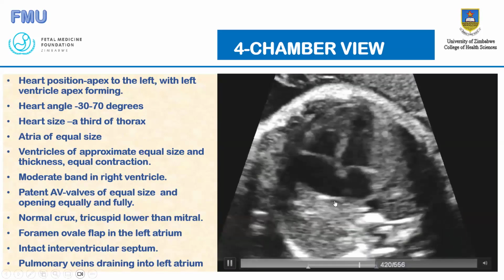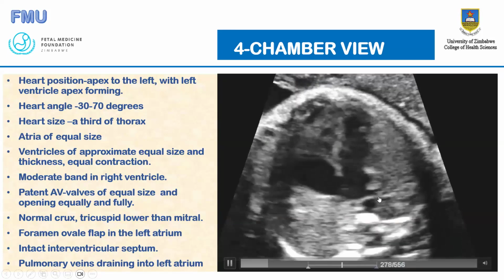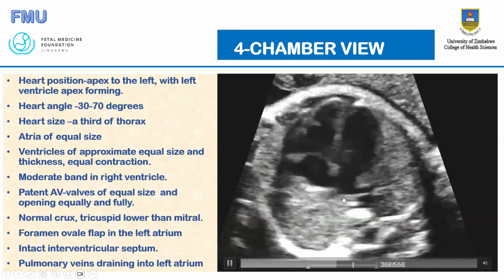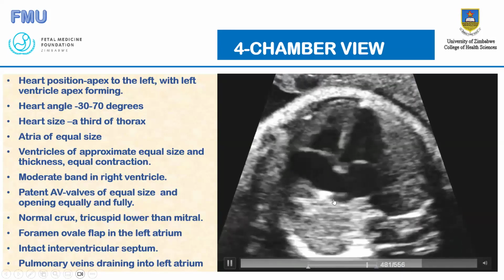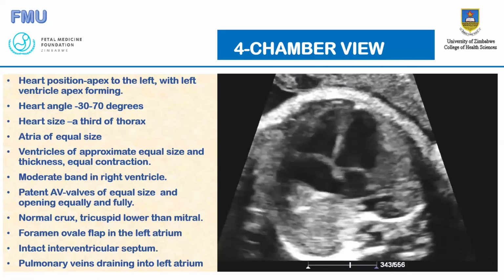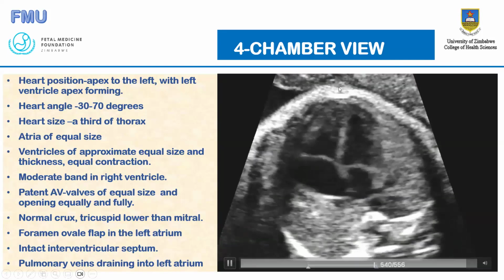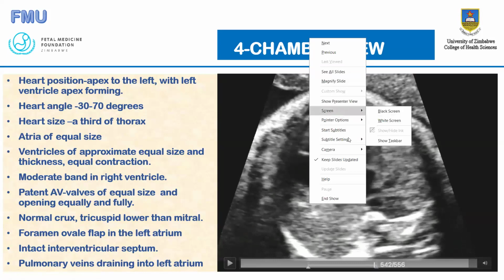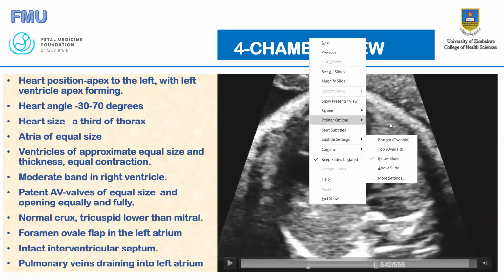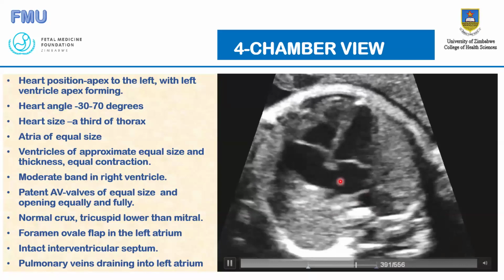you are always going to see the pulmonary veins going into the left atria. These are the pulmonary veins you see here. You see two of them in any given plane. There are four, remember, that empty into the left atria, but in any plane you can only see a maximum of two. So these pulmonary veins help us distinguish the right atria from the left atria.